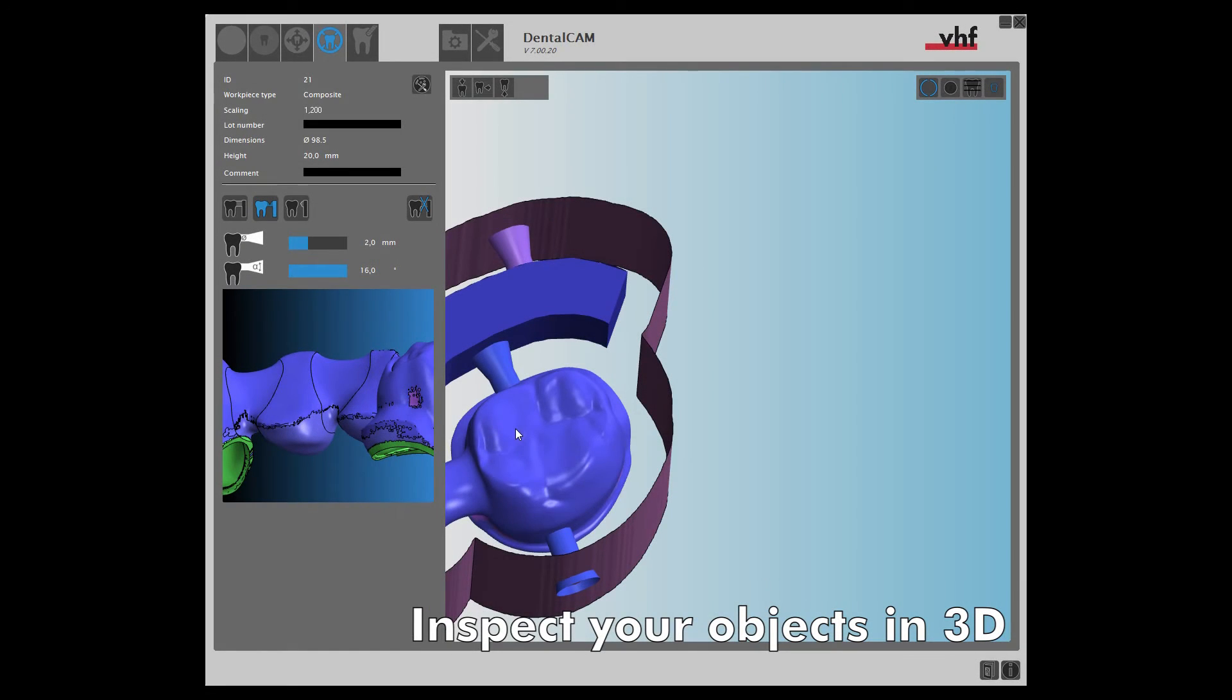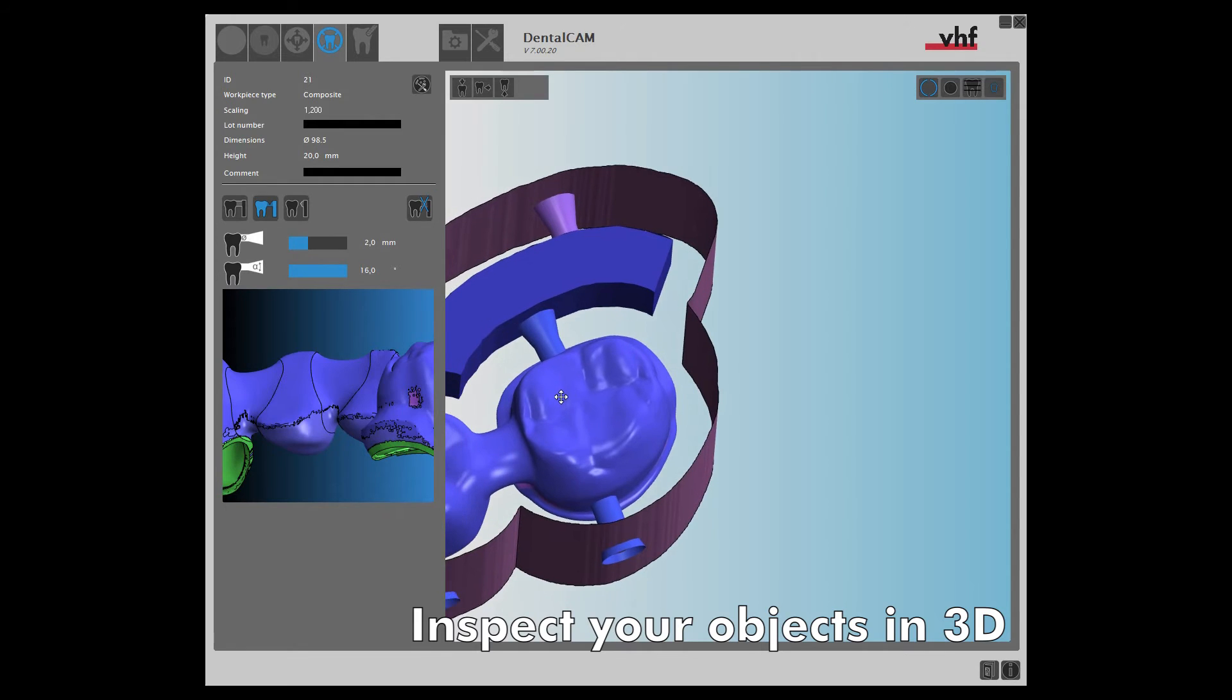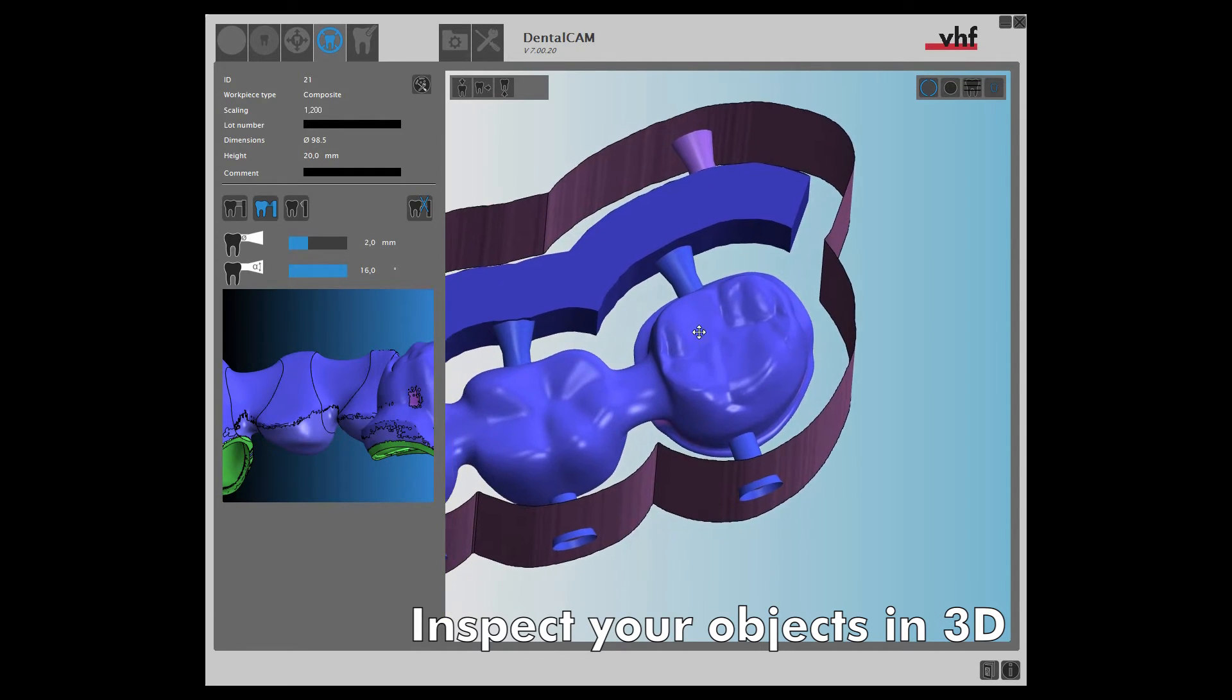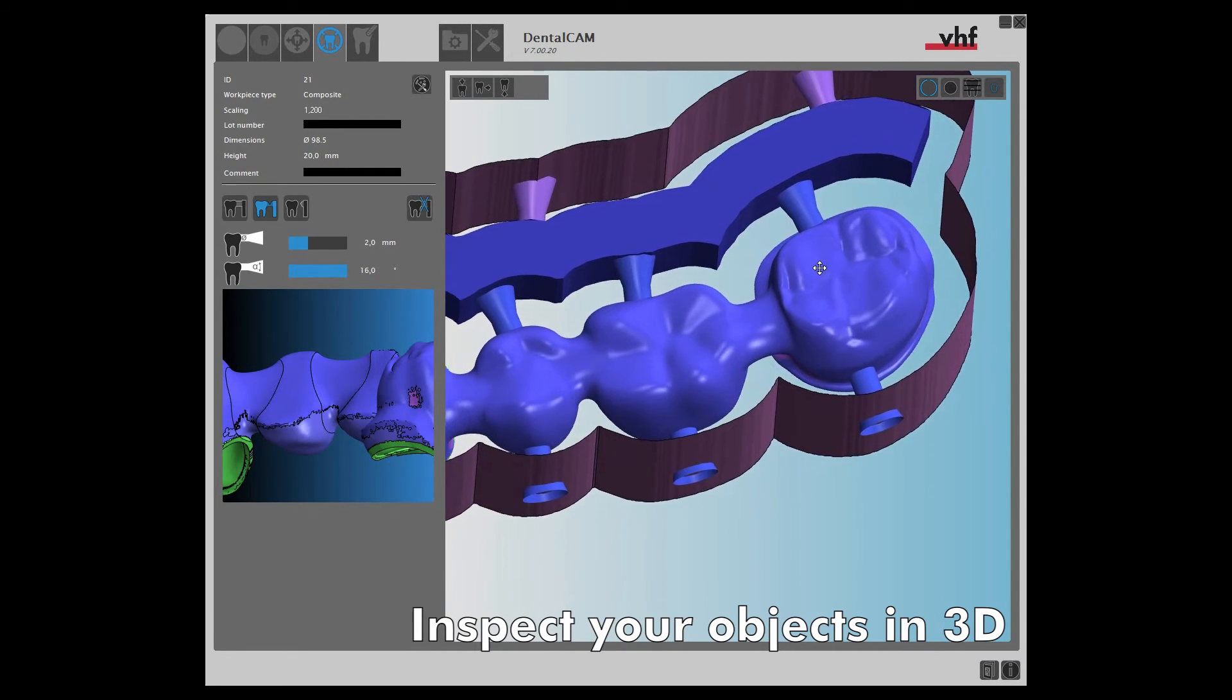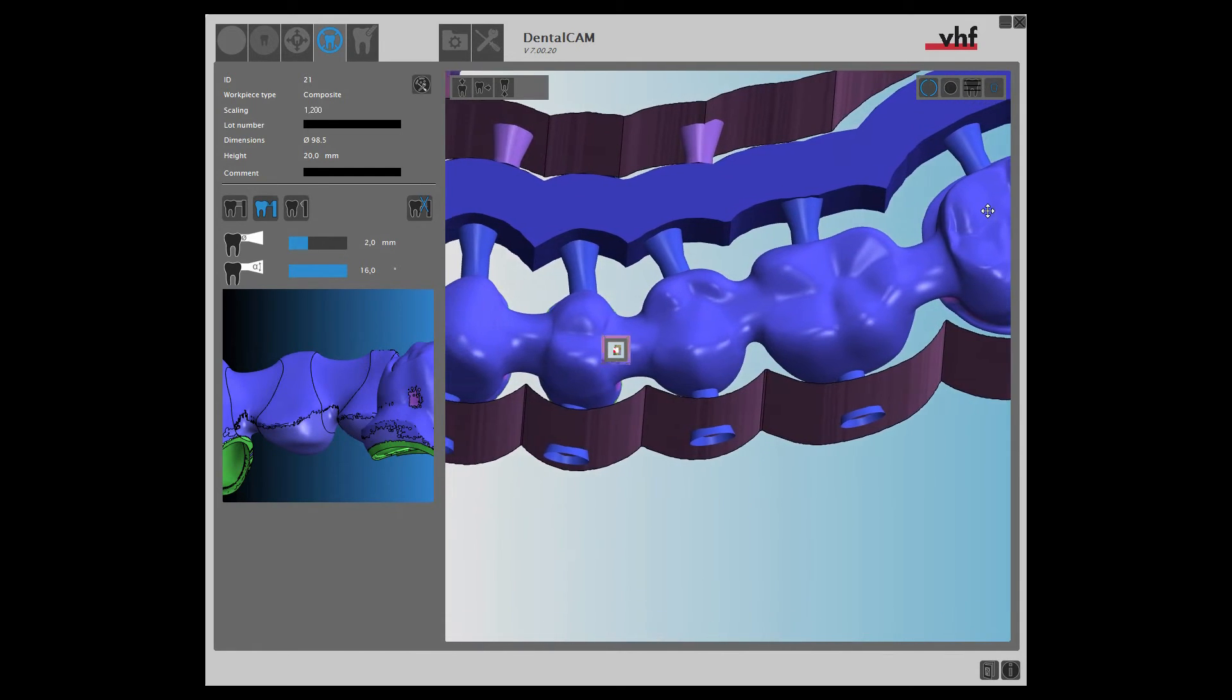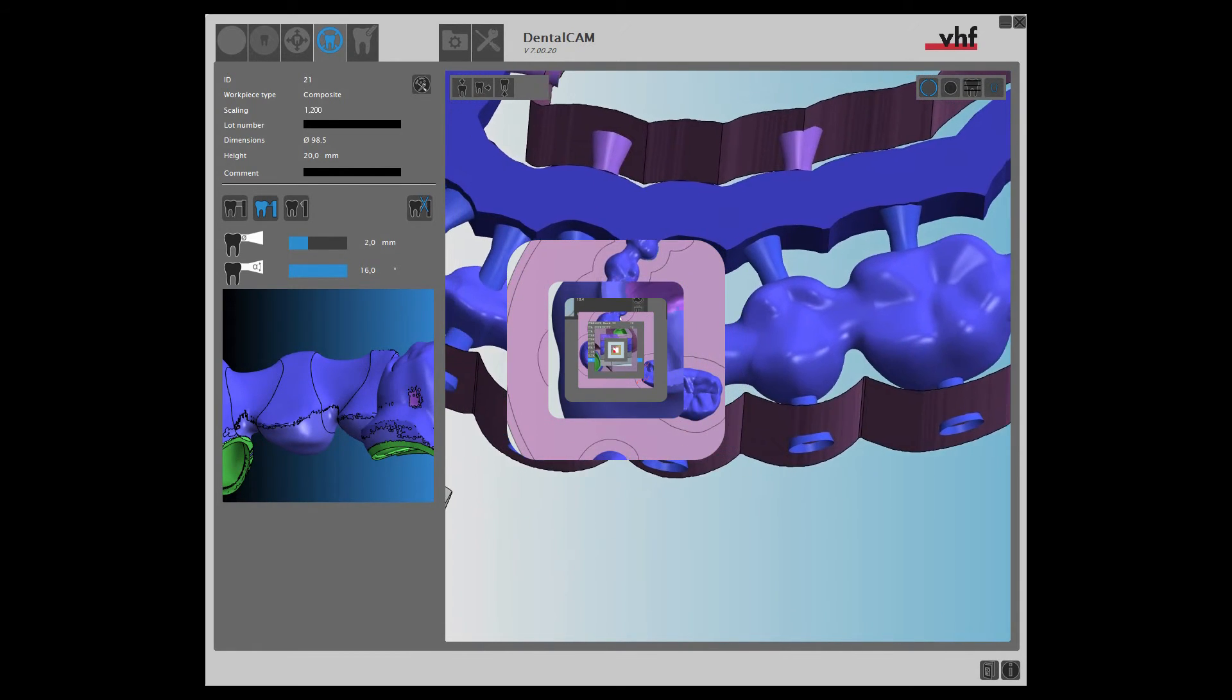After editing, you can check your nested objects in the 3D viewer. We hope you enjoy using DENTAL CAM 7, the next generation of milling excellence.